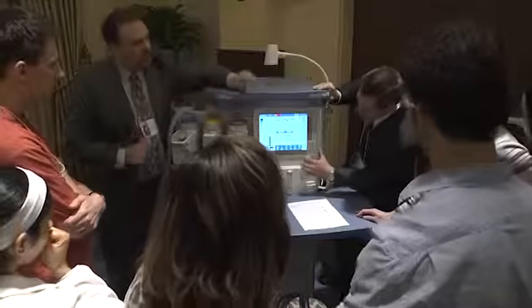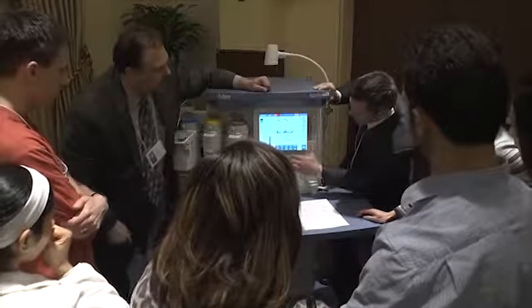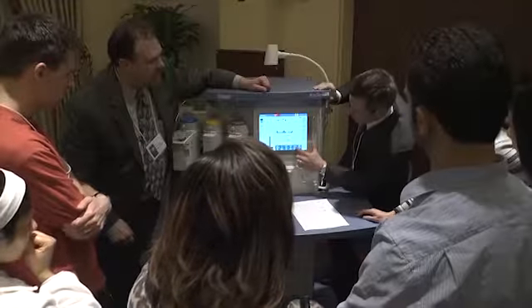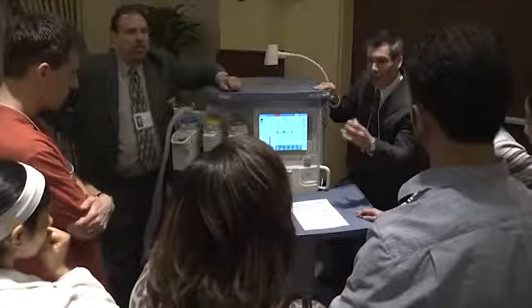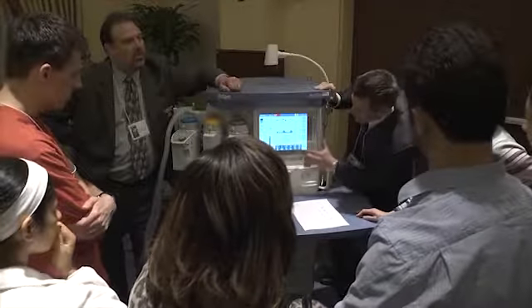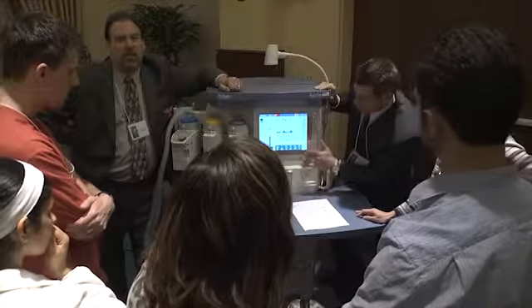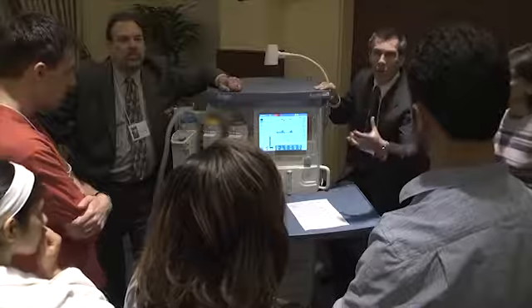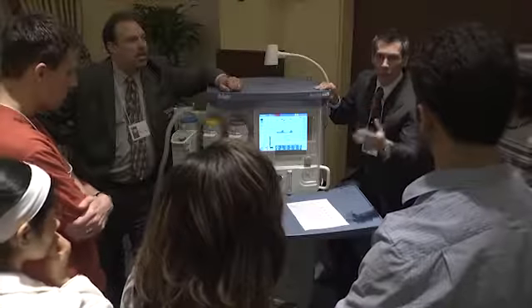What Dave showed you is that if you were to turn your trigger off and just set pressure support, because the definition of pressure support is that it augments your spontaneous tidal volume, if you go into pressure support and turn it on, it automatically sets the trigger. Right, because you have to trigger it spontaneously. So it automatically turns the trigger on.